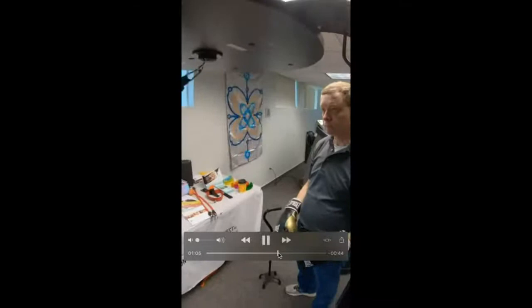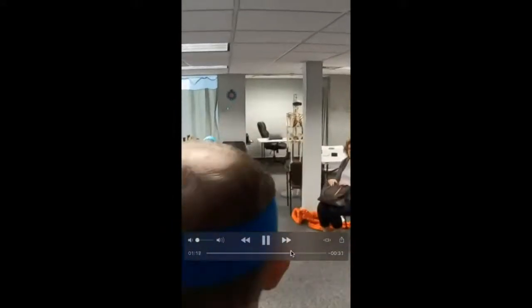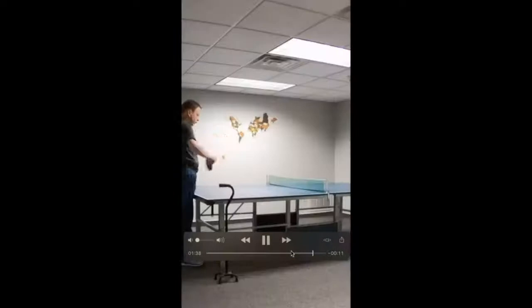And of course, they do a variety of different drills here, including using motion guidance with the laser, and just trying to keep that upright posture here as he's walking instead of constantly looking down toward the ground. So we're going to see the tremor. That doesn't bother us because of the known condition, right? But if he can start working on upright posture and moving around, using some gaze fixation, it's going to help with other motor control activities like you're seeing here. Definitely wouldn't want to be the person doing the video capture there in front of that guy.